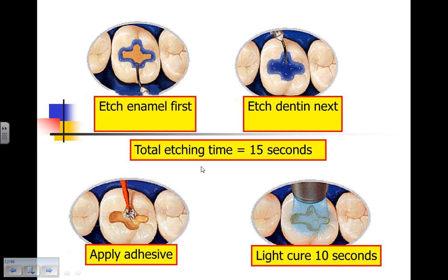moisturized dentin. You then apply your adhesive. Following the instructions for the adhesive, a dwell time of typically 5 seconds. Air evaporate off the solvent from the adhesive and air thin it, and then light cure it with the light at right angles to the occlusal surface, as close to the tooth as possible. And on larger preparations, you may have to place the light over the mesial separate from the distal. Certainly class 2s and MODs, 2-surface and 3-surface composites in the posterior are going to require multiple light curing, especially on molars. Premolars, generally the light centered on the tooth will be adequate.